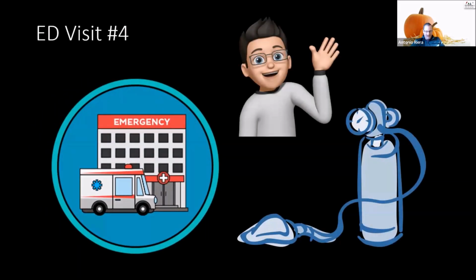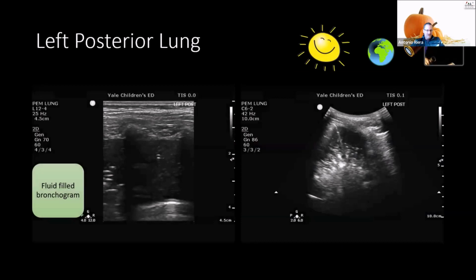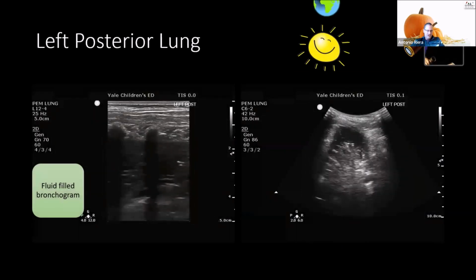But she returns less than 10 hours later to me in the morning, and I say, "Hi, I'm Dr. Antonio. I love to do ultrasound. We're going to do ultrasound and see what's going on because I'm confused, and I don't want to do a 4th x-ray." Also, I remember this dad was so nervous. He was palpably shaking in the room just because his daughter that was otherwise healthy has this pneumonia that just won't get better.